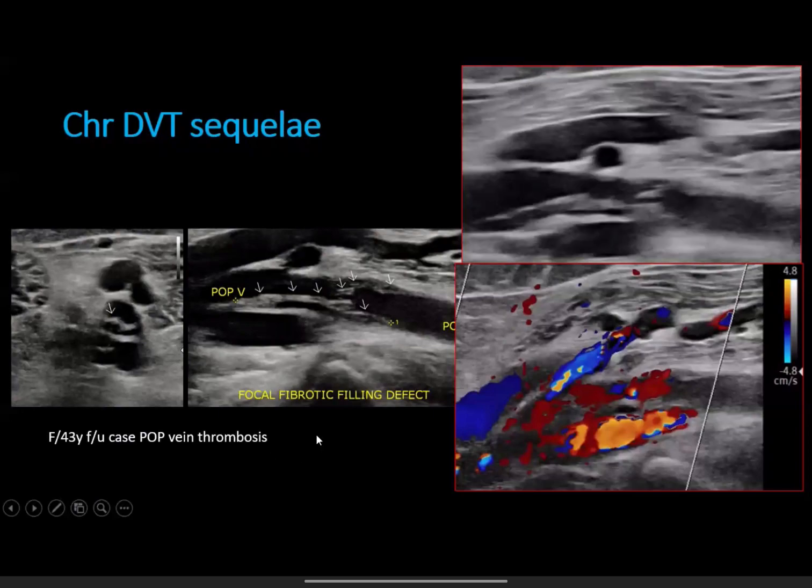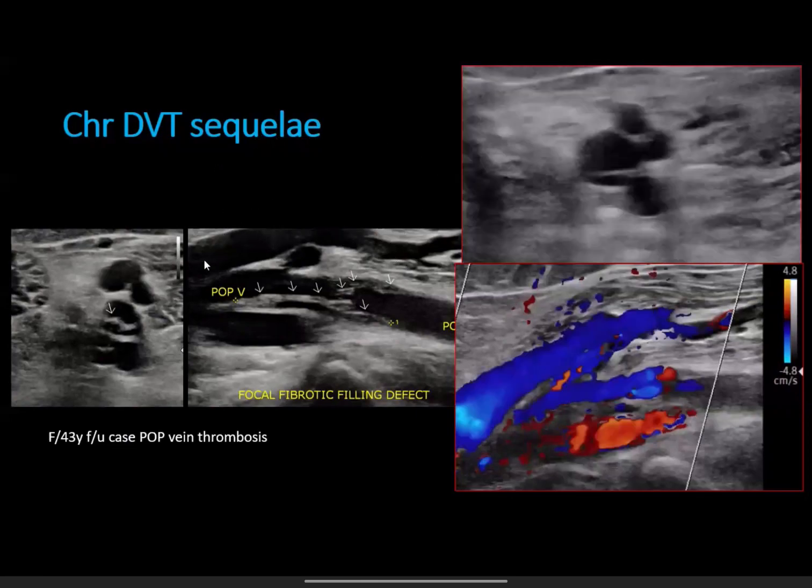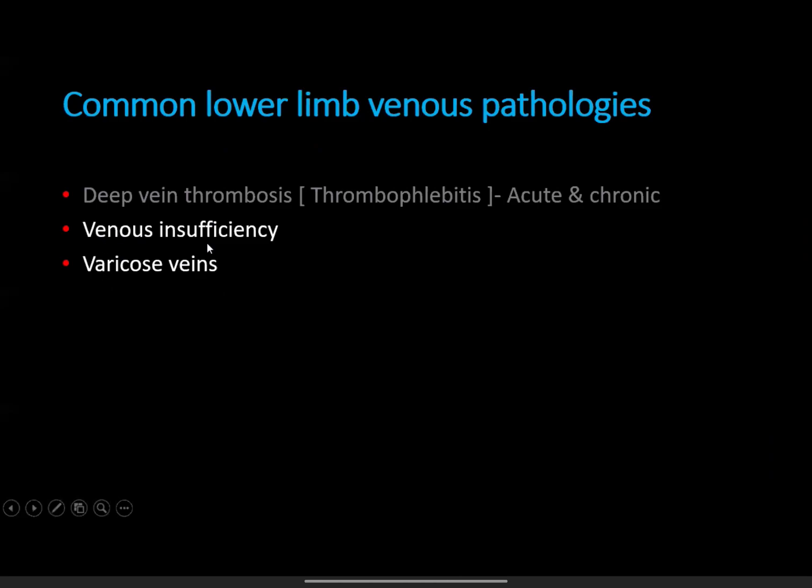The same case. Now coming to another pathology, that is venous insufficiency and varicose veins. We understand these both conditions simultaneously.